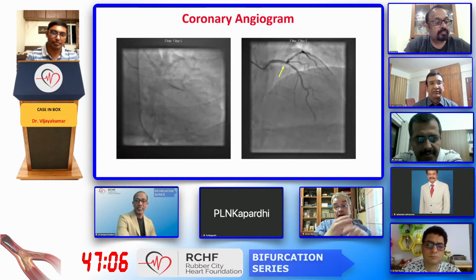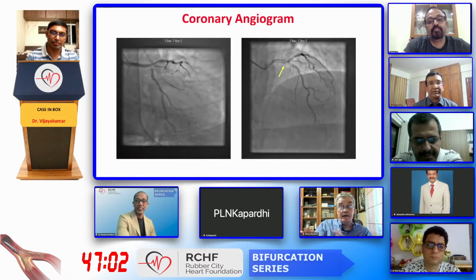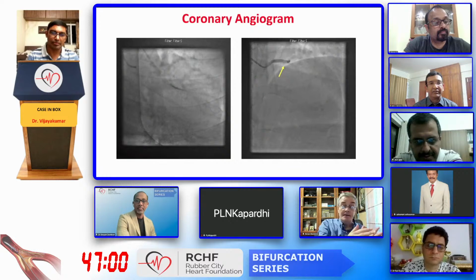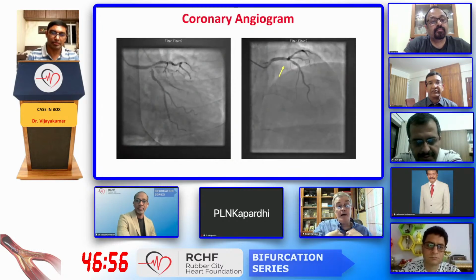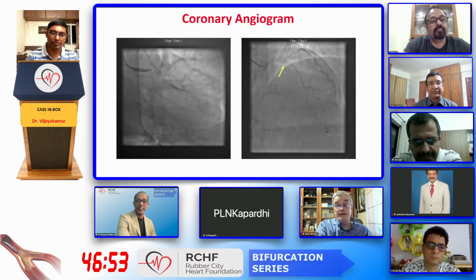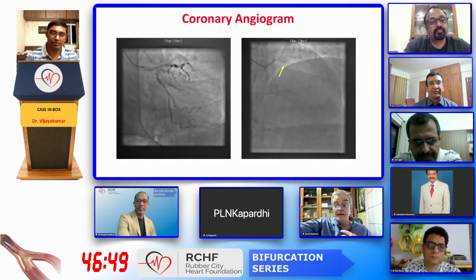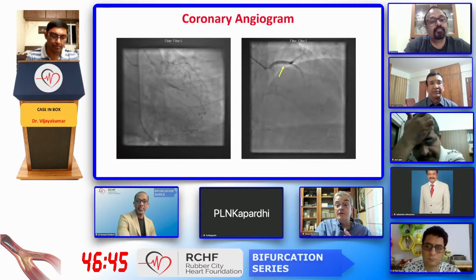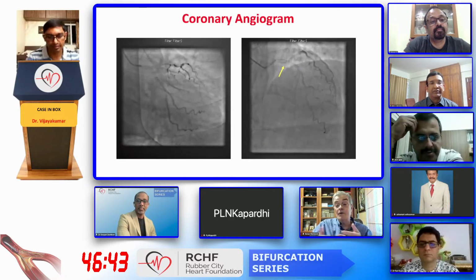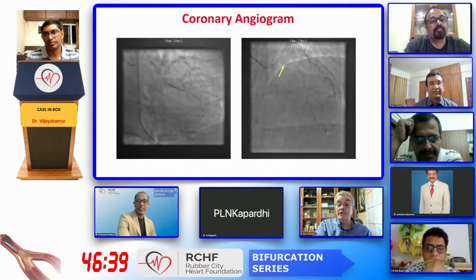The only difference is that sometimes people prefer to do DK crush, stenting the side branch first. As the European Bifurcation Club, we do something similar. We will stent the circumflex first here, but stenting from the proximal main vessel, from the left main into the circ. So it's sort of inverted provisional, but it's more or less the same as DK crush, securing the circumflex first.